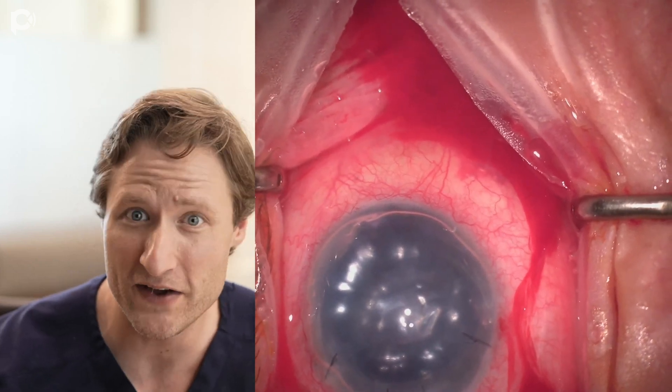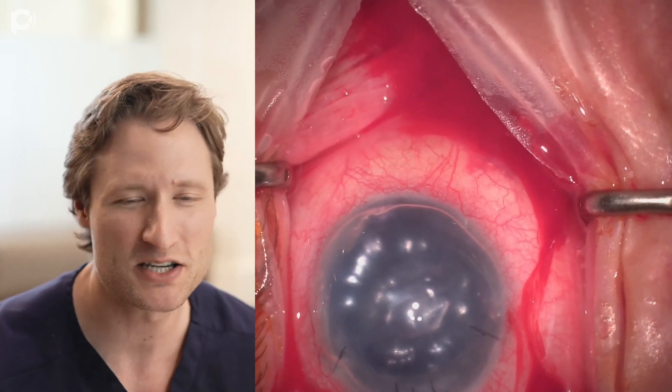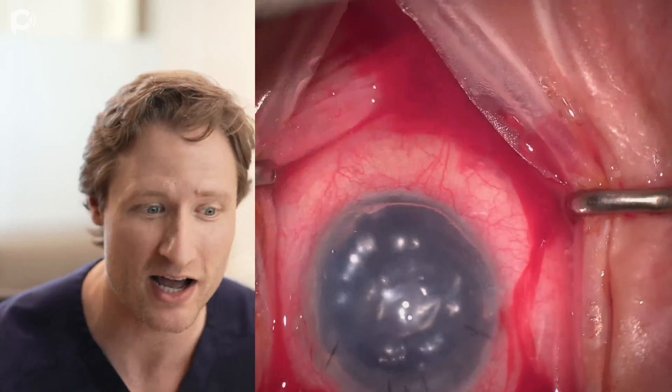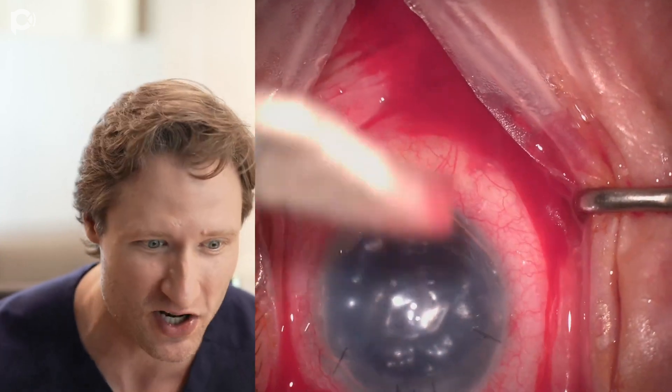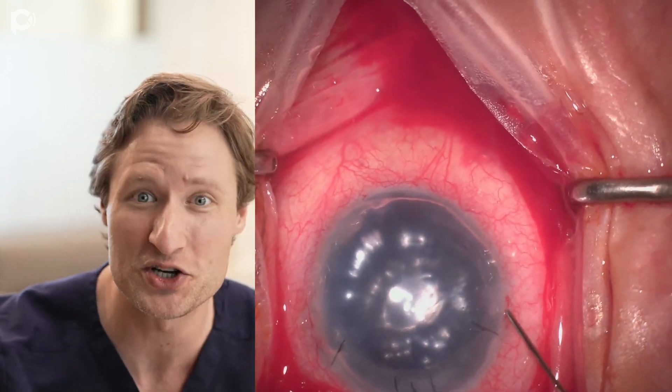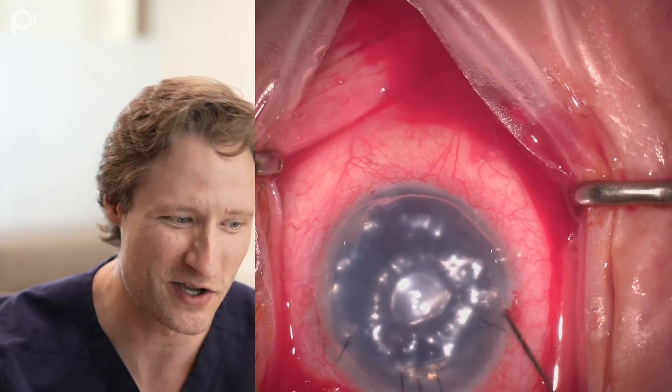I'm applying a few shuffling bumps in the center of the cornea to center the graft and lift it up to the back surface of the cornea on an air bubble. This is what the eye looks like at the end of the operation. I'm pressurizing the eye fairly firmly because I'm not worried about pupillary block — not only does the patient have multiple iridotomies, but they also have a functional tube shunt. We conclude the case.